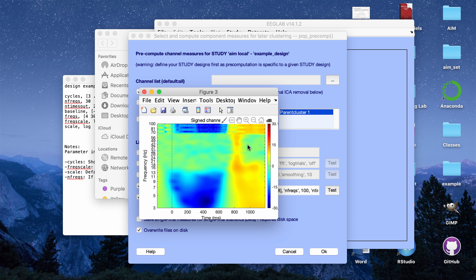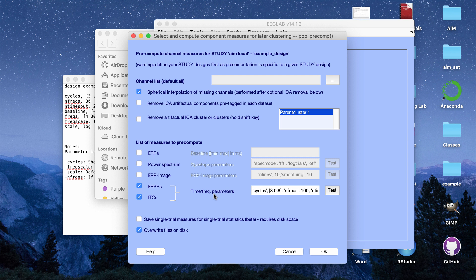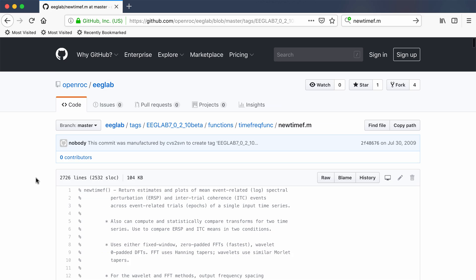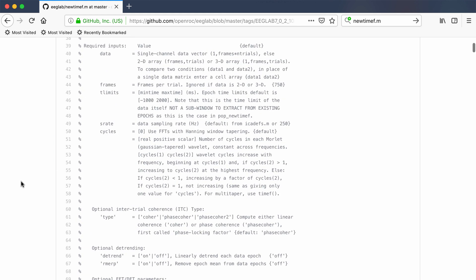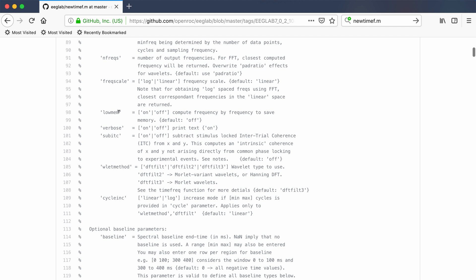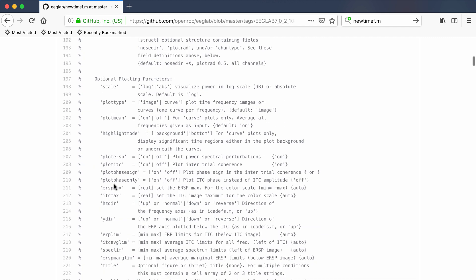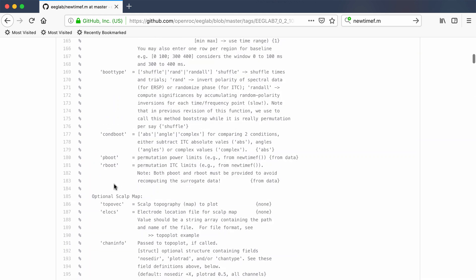The way the parameters are set right now, a computed time frequency plot would look like this. This GUI is essentially running a function called newtimef. If you want to know all the possible parameters and how they affect the output or physical appearance, you can look at the documentation online — the function is called newtimef in EEGLAB and the scripts are publicly available on GitHub. This gives a full explanation of all optional and required parameters and how the different options affect the output.